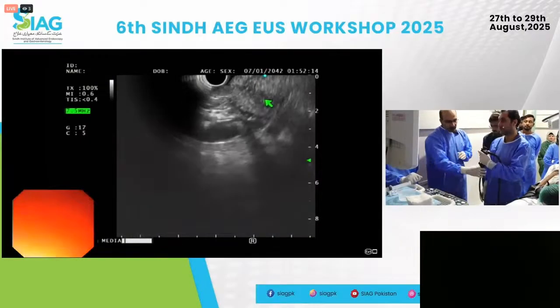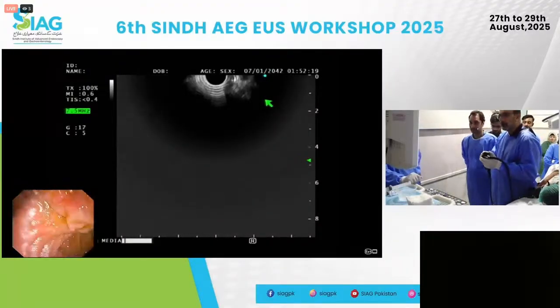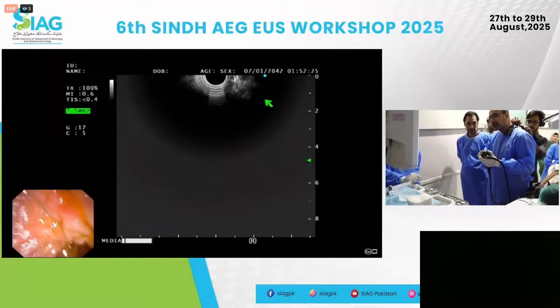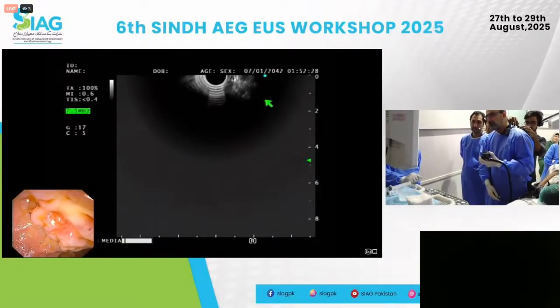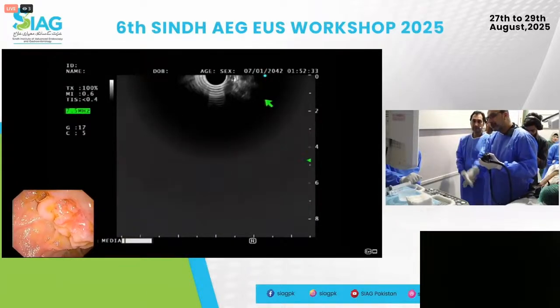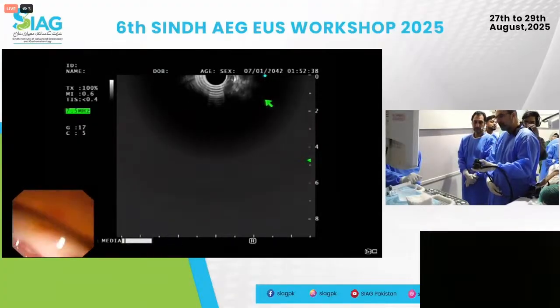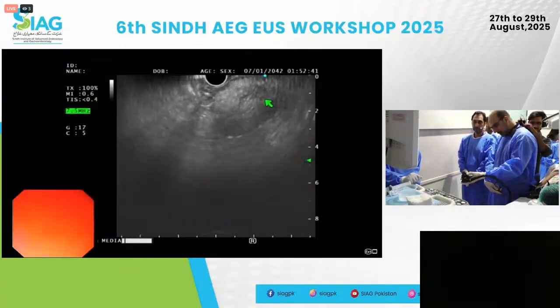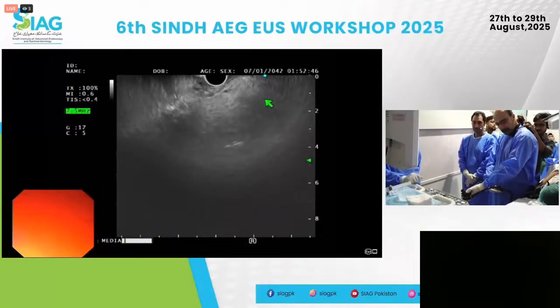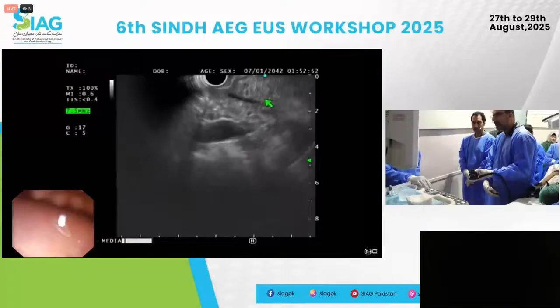The biggest issue here is not that you don't know what to do, it's you not letting go of it. So here, firstly, I always like to look at it endoscopically. Just a gentle amount of big wheel towards me, and again, I do this thing with the U-turn on my scope and go clockwise like this. I'm using my shoulder. Counter like this, okay? And this is what I was trying to make you do.